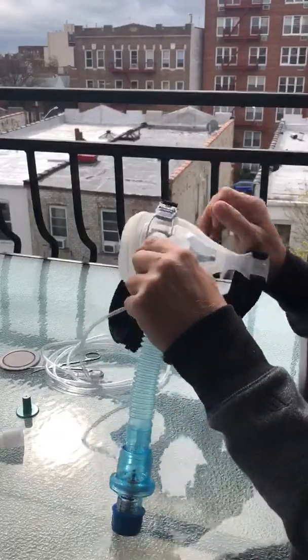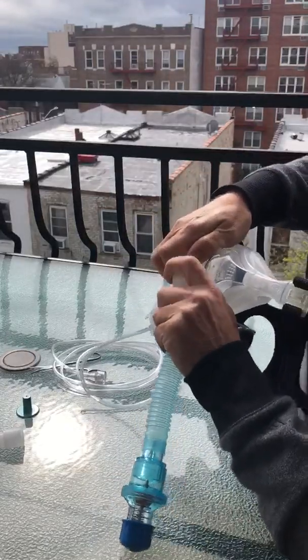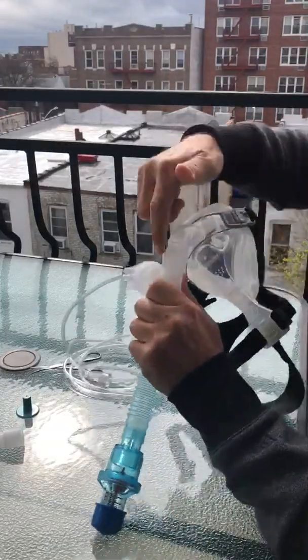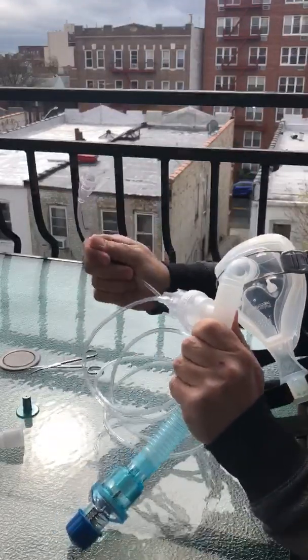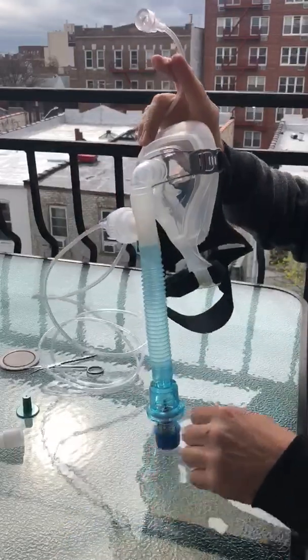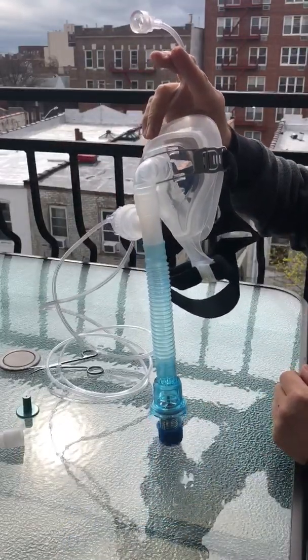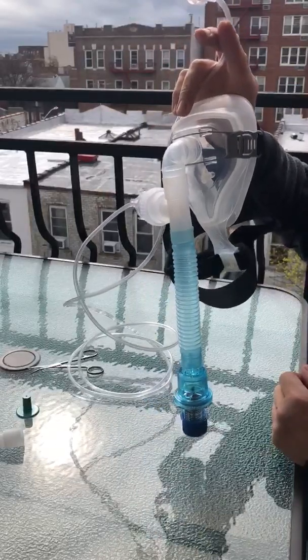Attach the mask to it. Put a little bit of silk tape around there just to make sure it doesn't pop off. Hook this to wall oxygen and you're good to go. Everything is set for a nice wall-mounted CPAP device. We call this device the Silverberg Snorkel, because you can't get coronavirus underwater.